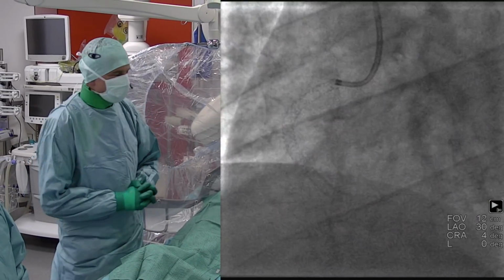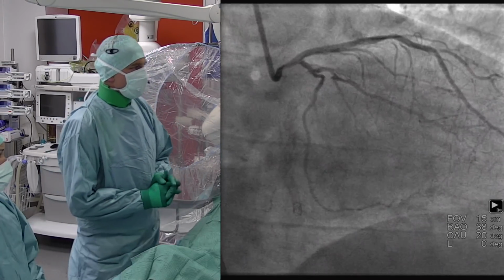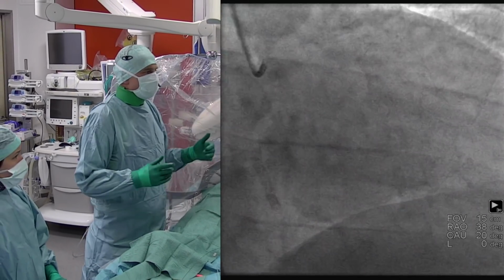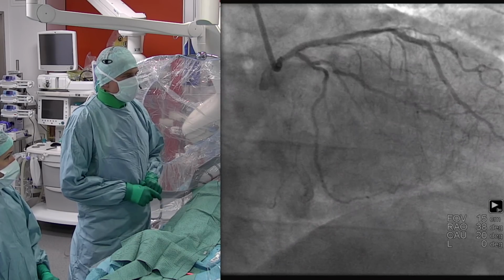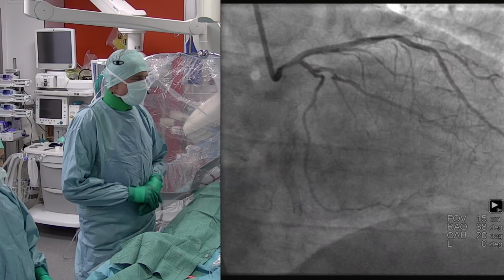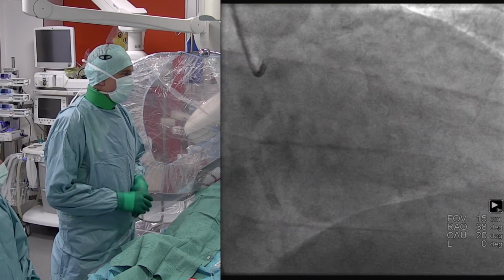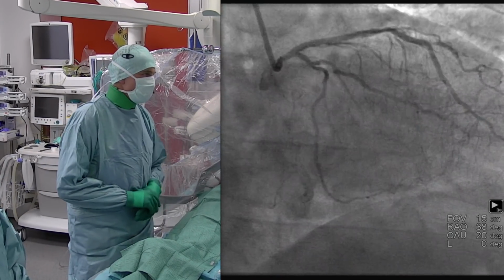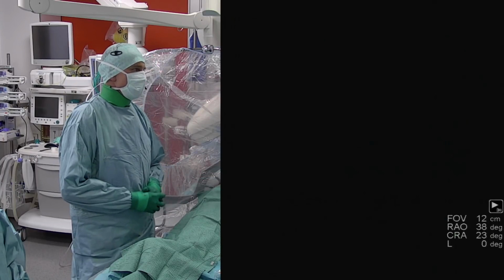Now go to the left, Katja, and in the left you will see what you have seen already, a kind of smallish left main. I cannot say that there is a focal stenosis, and you see that also in the mid-LAD there is something which is irregular. I would say by visual estimate 40%, and the left main I would say, well, it must be 50% or 40-50%, so between 30 and 70%. Next, Katja.